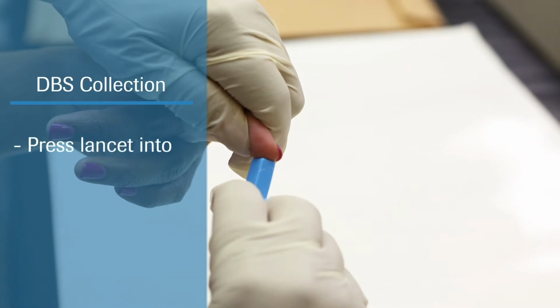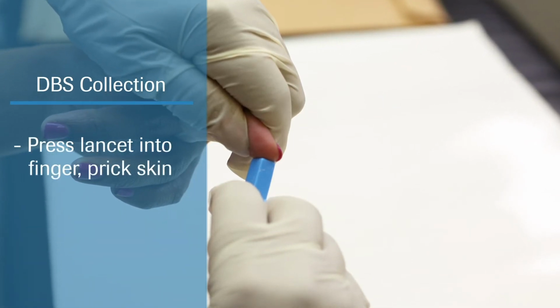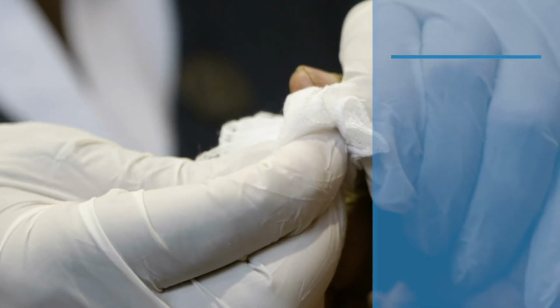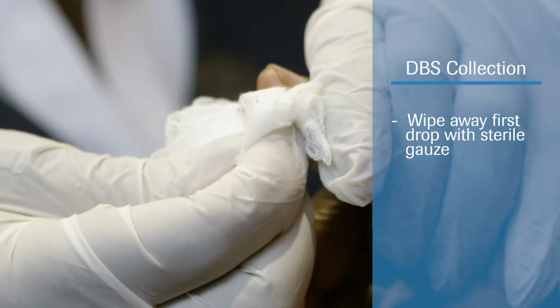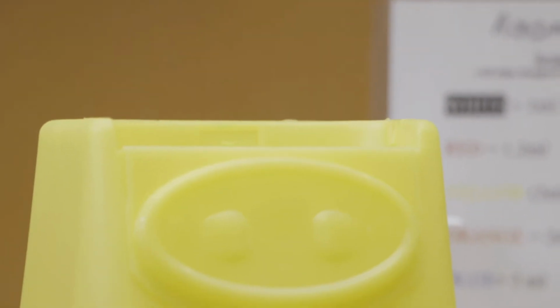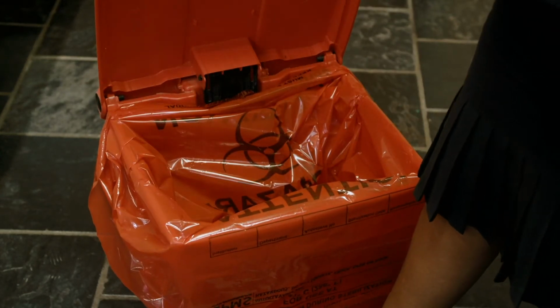Note how the nurse is holding the hand firmly and pressing the lancet into the finger before depressing the trigger. Wipe away the first drop, which contains tissue fluids mixed with blood. Remember to properly dispose of the lancet in a sharps container and the gauze in a biohazard container.